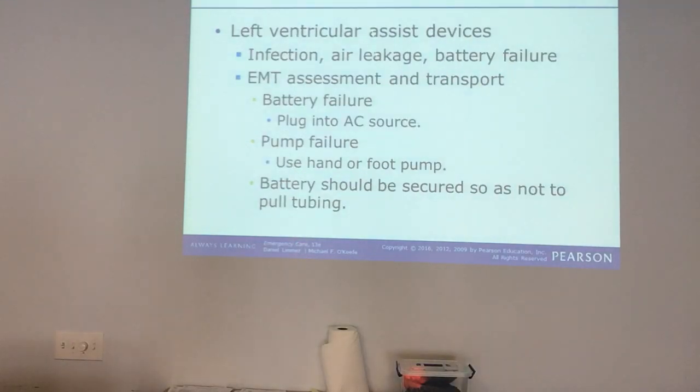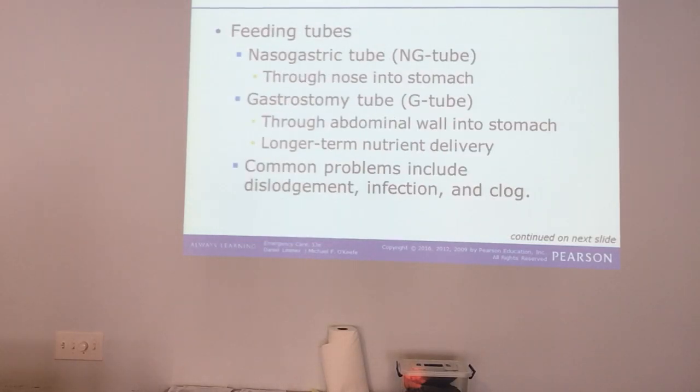You will not feel a radial pulse with an LVAD. It's like a constant pump, okay? So you're not going to feel a pulse, radial or carotid. You shouldn't start CPR unless you think they're dead, okay? So if you do some stimulus and they aren't waking up talking to you, then you can start CPR. But most of these patients are just fine. You're not going to get a pulse or blood pressure.